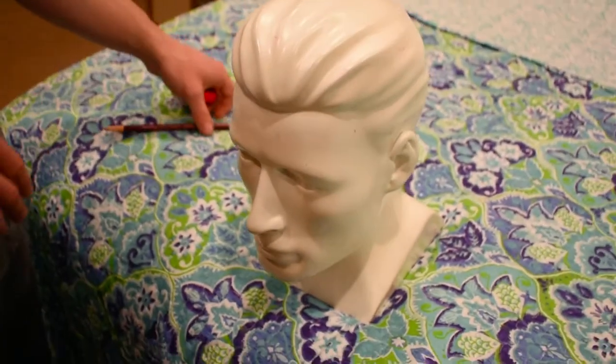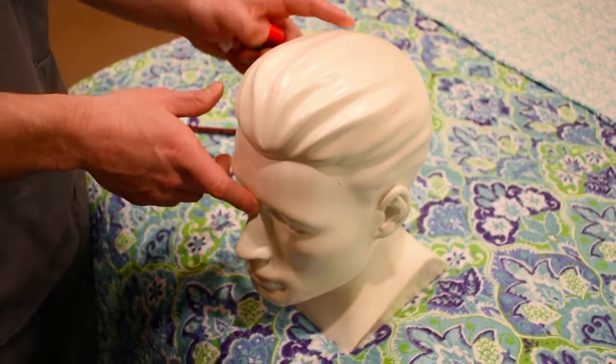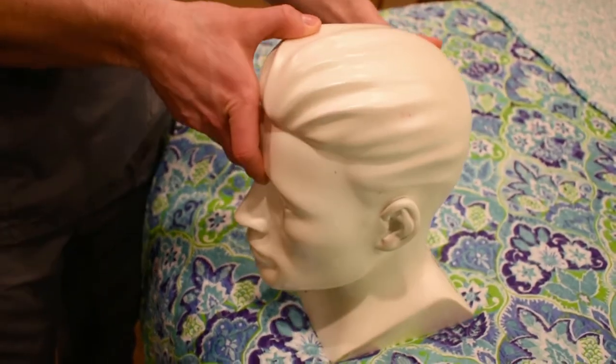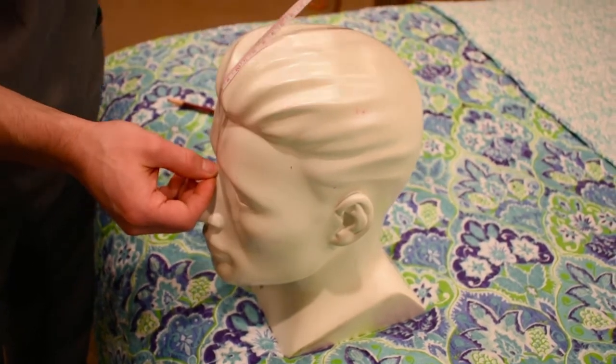Okay, so to start, the one measurement that you want to start with is measuring from the nasion, which is the bridge of the nose, to the Inion, which is that occipital protuberance. So once we do that, and it's easier to measure in centimeters, not inches, so we're going to go ahead and do that.